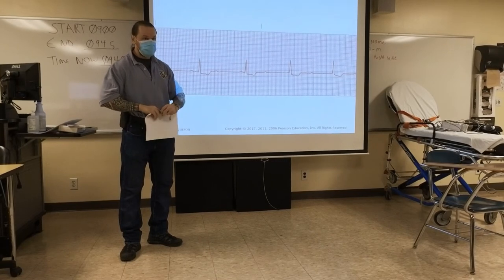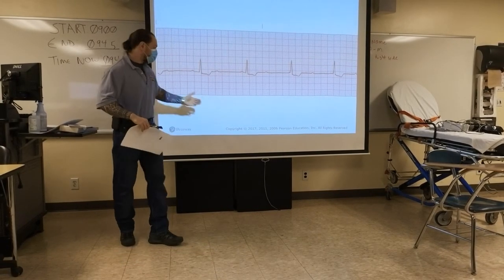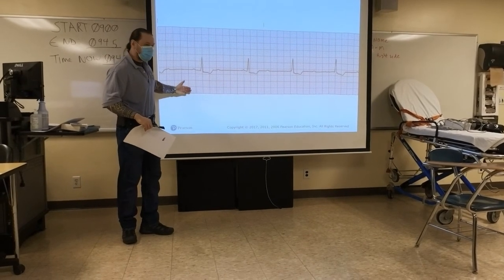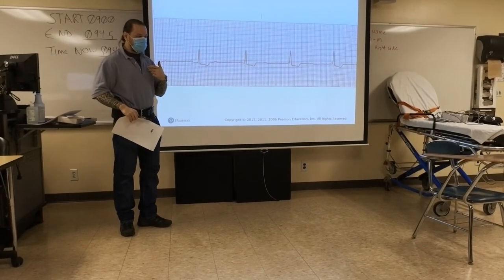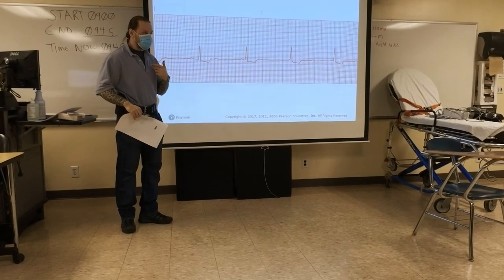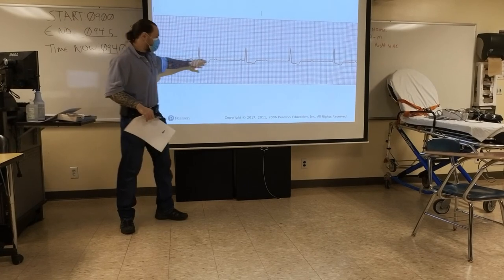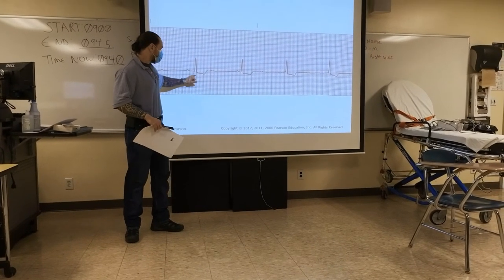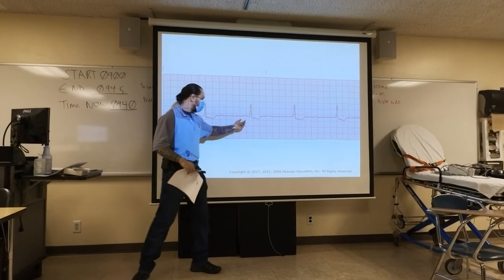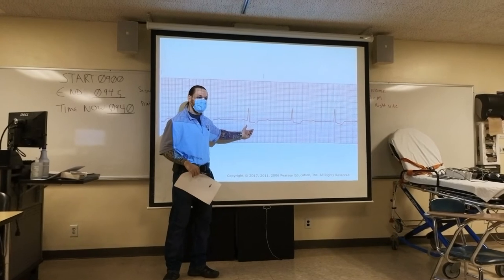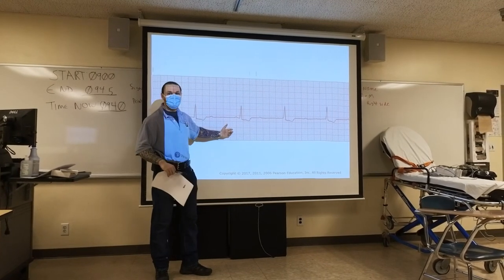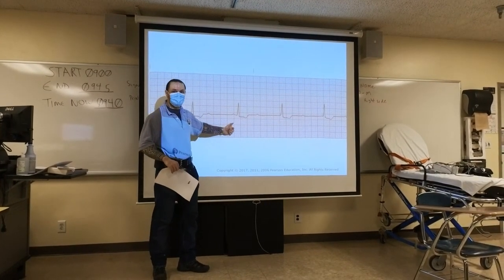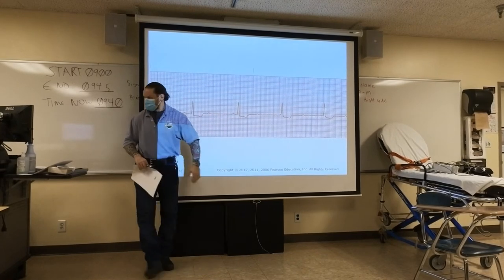Third degree heart block. If you apply the systematic approach, you will get to the correct interpretation. Usually in third degree, we have a regular rhythm, and there's some abnormality where the SA node is not communicating through the AV node to the ventricle. So atria beat at their own rate, ventricles at their own rate — they are not talking to each other. Why is the QRS narrow and not wide? Maybe the impulse is coming somewhere from the node, not all the way lower in the ventricles — a normal junctional escape rhythm. Junctional rate is 40 to 60, which fits.